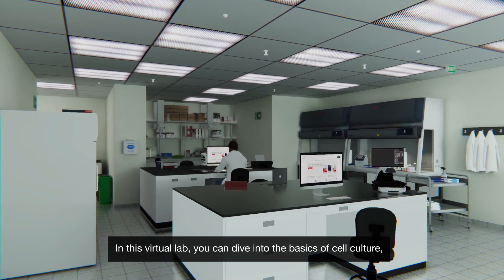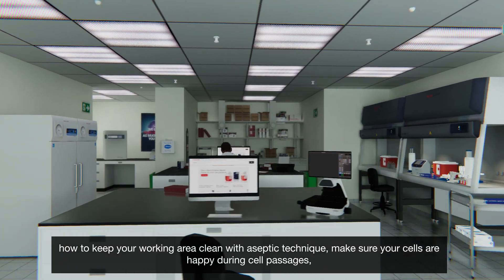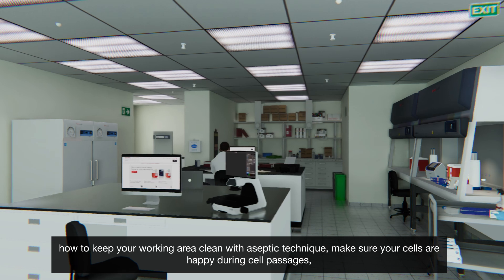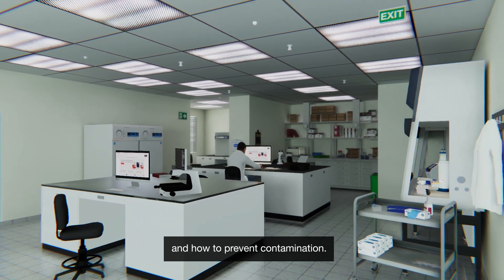In this virtual lab, you can dive into the basics of cell culture, how to keep your working area clean with the aseptic technique, make sure your cells are happy during cell passages, and how to prevent contamination.